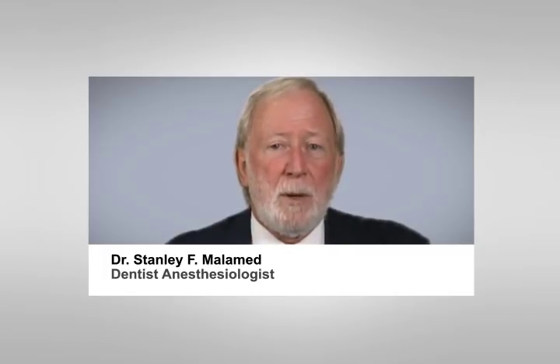The dynamic pressure sensing technology designed in the STA system allows you to have continuous real-time pressure sensing feedback during the injection. The STA system will assist you in finding the optimal injection site to place your needle by offering audio and visual confirmation. It will also maintain controlled pressures below the patient's pain threshold. Let's discuss how to begin.